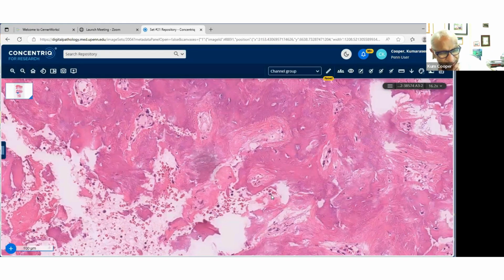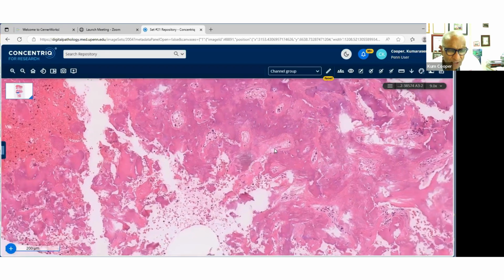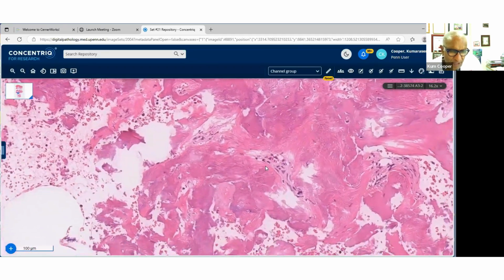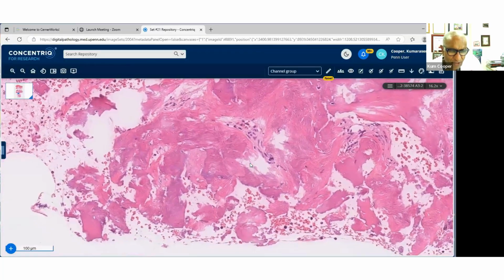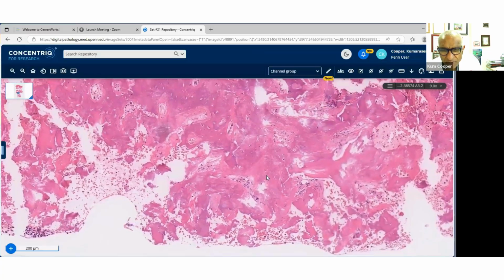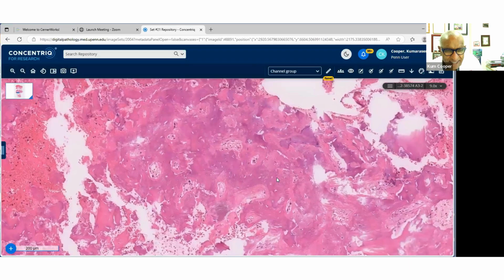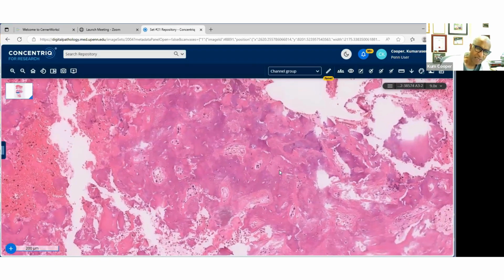Paget's disease of the bone, as you are aware, typically has a raised alkaline phosphatase, which we ask them to do in serum, and radiology concurred with that impression as well. So this is non-neoplastic, but as you know, Paget's disease can predispose to osteosarcoma. But this would be the late stage of Paget's disease, where the bone is pretty much all sclerotic.